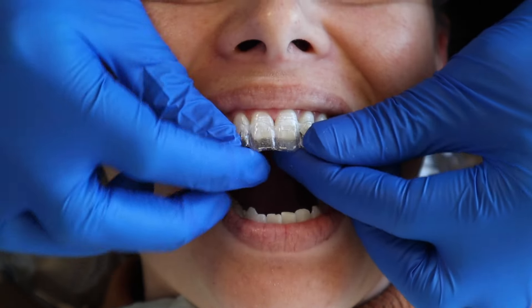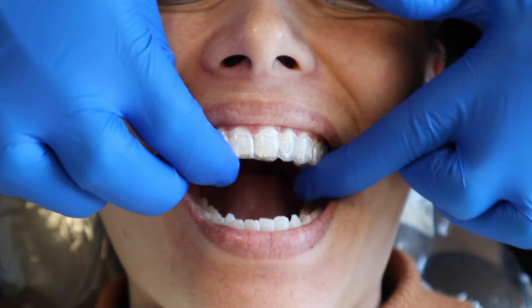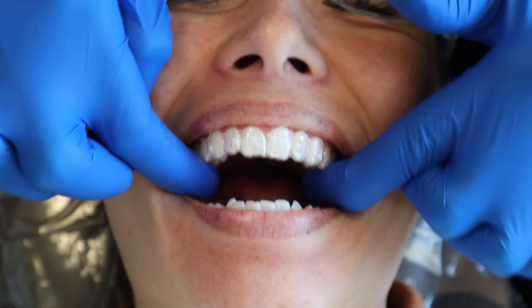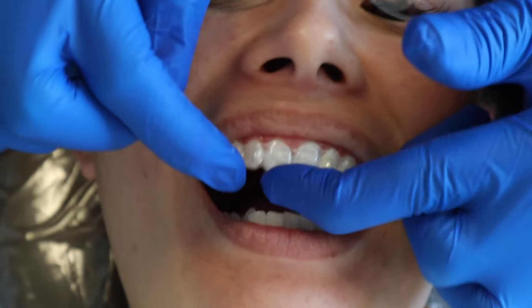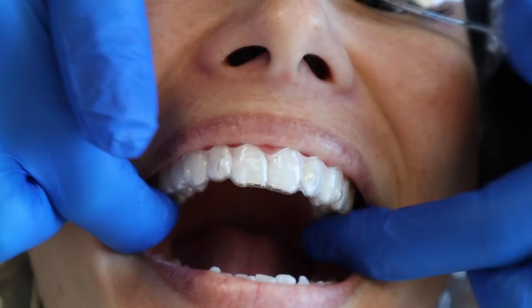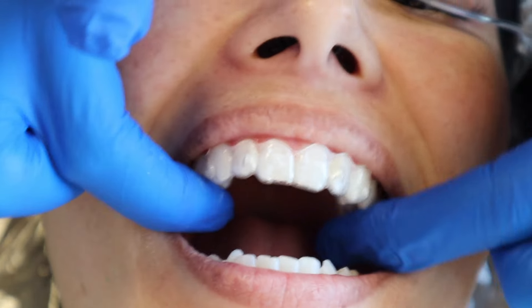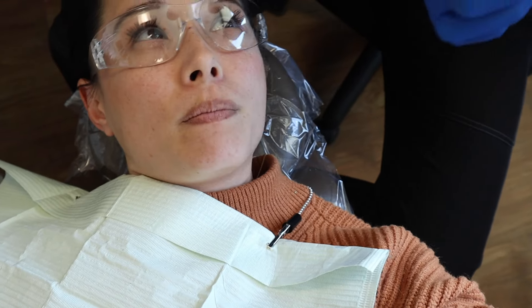So you align it with your two front teeth and you just push it in. As you can see, this is a lot thicker than the other one. You have two indentations right here, and you want to make sure this is seated all the way. The edge of the tray should be completely flushed with the edge of your teeth, and there shouldn't be any movement. Congratulations — your first tray. One step closer to straight teeth. It does feel thick, but not too bad. You may lisp a little bit, but the lisp will go away. These are in lieu of the metal bracket and hold the wire, so they have to have thickness to it.